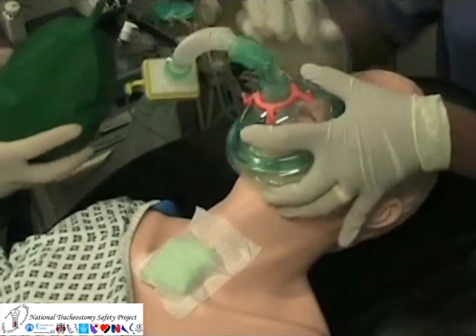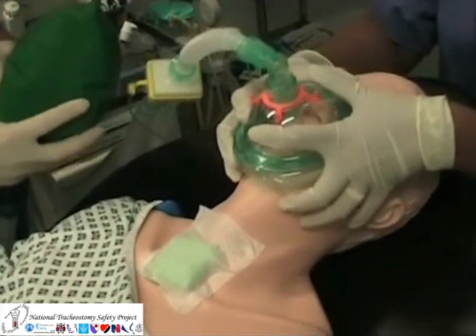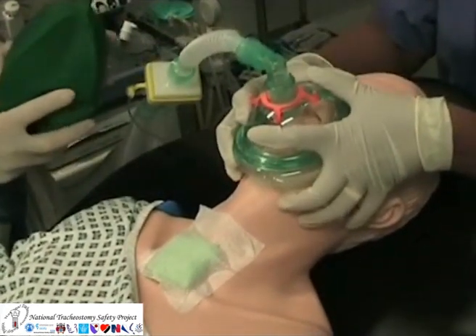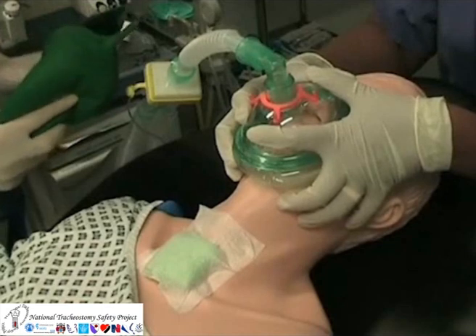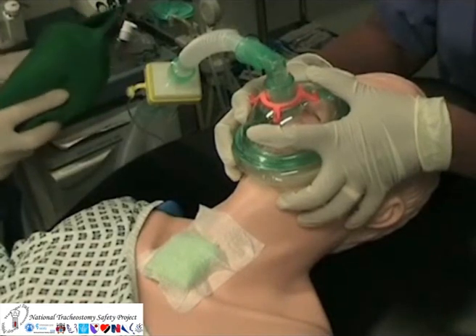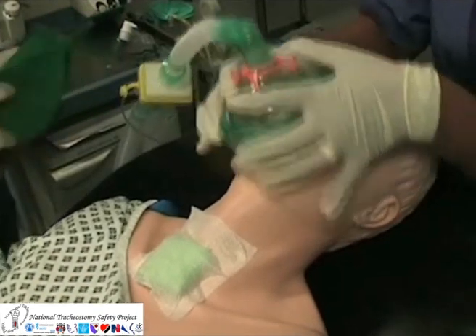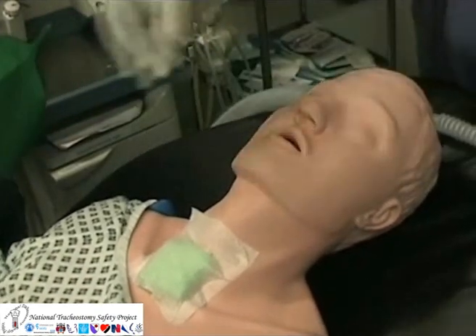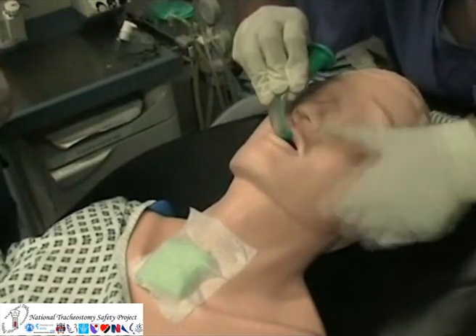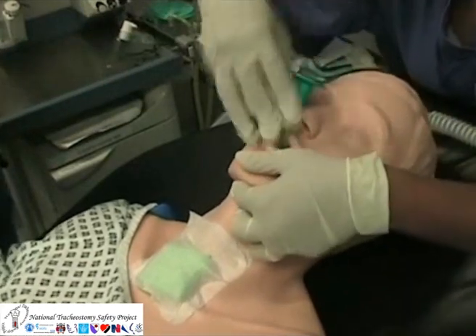Standard manoeuvres include using a bag, valve and mask as shown here, or moving to use oral airway adjuncts such as oral or Guedel airways or nasopharyngeal airways.